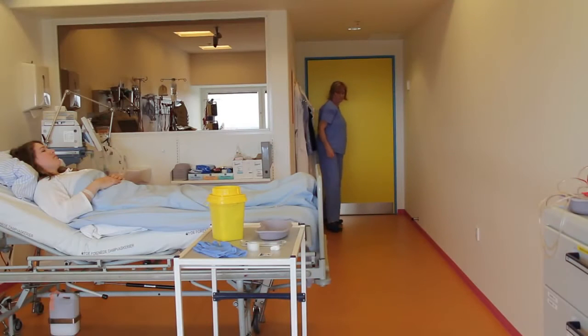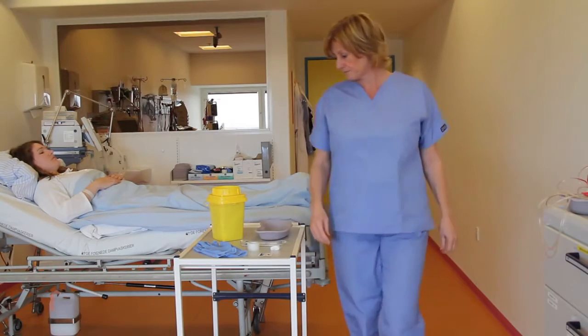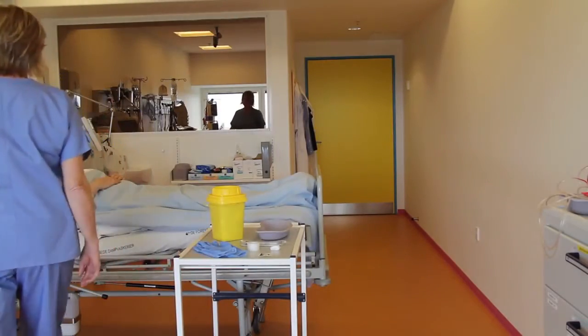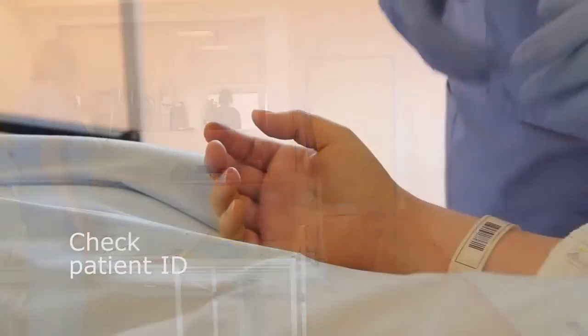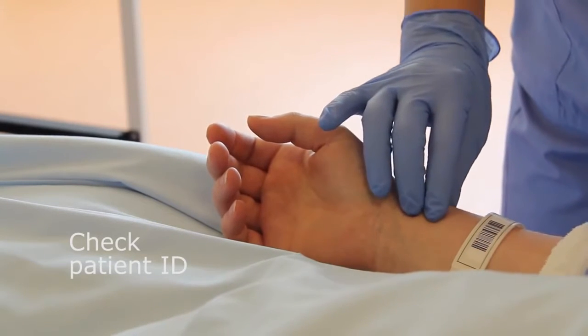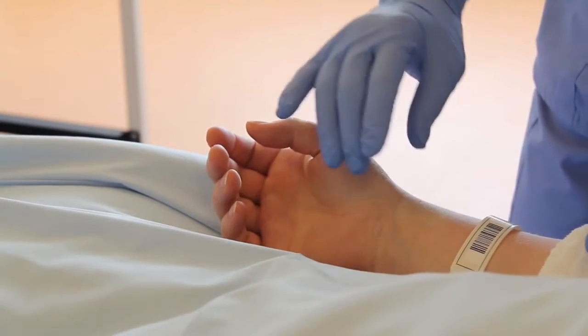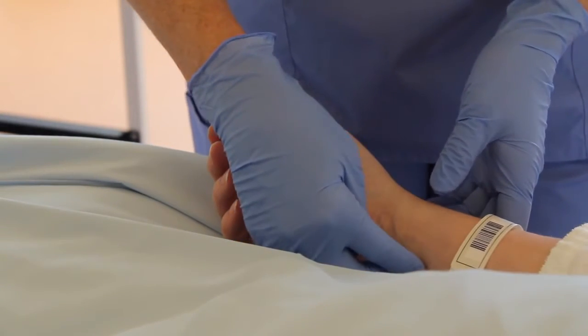This is an instructional video about how to perform an arterial puncture. When sampling, be sure to always follow your hospital's procedures. Before sampling, confirm the patient's identity. If a recent change in the oxygen flow rate has been made, wait approximately 20 to 30 minutes before sampling.